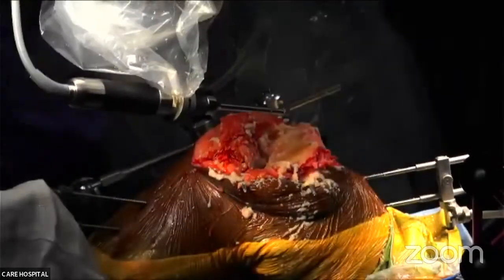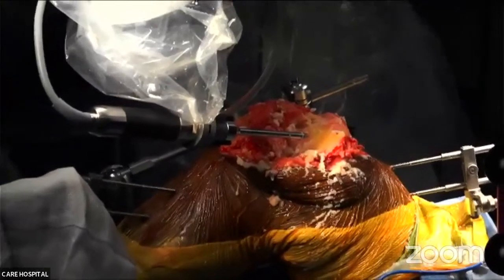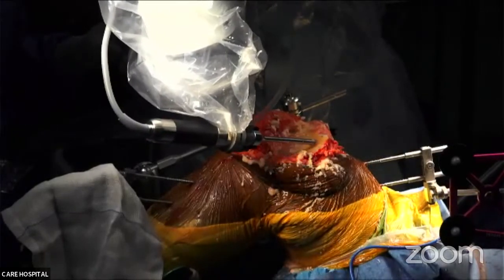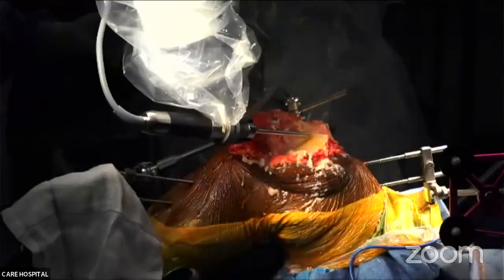Not very fast, but it is fast. Now it is taking the anterior chamfer cut. So it will take all the 5 cuts in the femur.